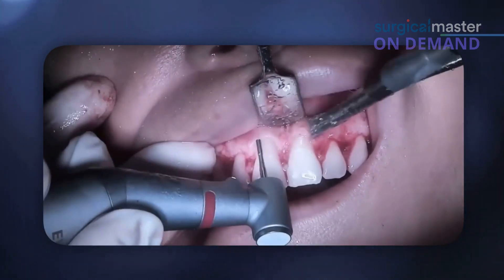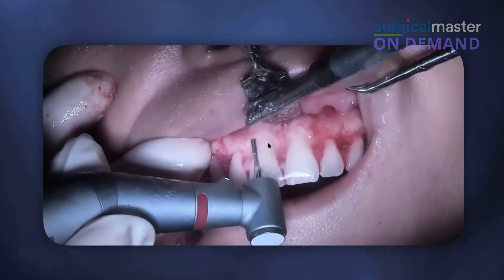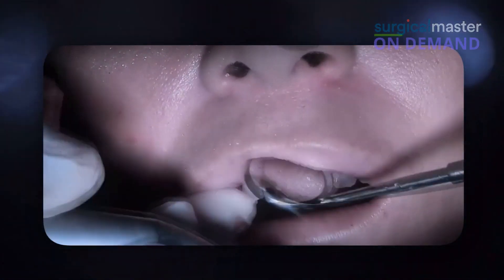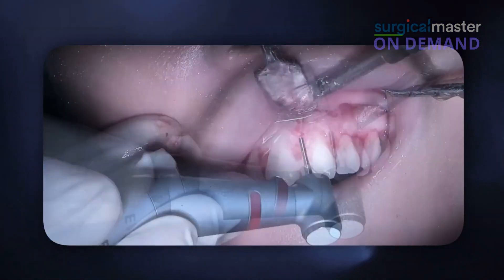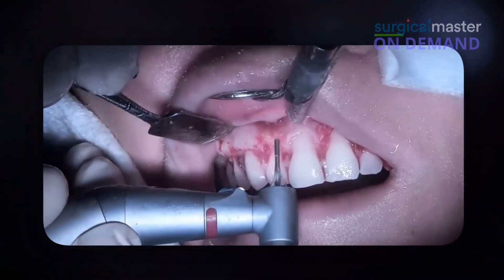Okay, so I got the height that I wanted. I'm not worried about the step — I'm going to get rid of it with the next bur. I always start with the laterals, by the way.